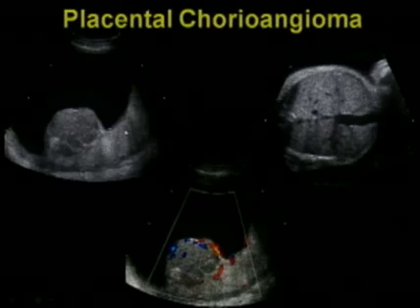there's the end of the placenta, a large chorioangioma, with blood flow around it. They can lead to fetal hydrops in some cases. And here we see the early phase of hydrops, which is a dilated umbilical vein. And this is due to vascular steal phenomenon through the chorioangioma.